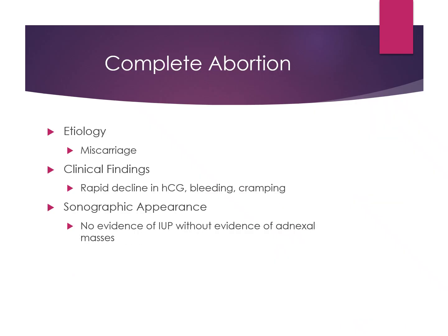So a complete abortion, on the other hand, is not going to be considered a demise. It is considered a complete abortion because everything was able to make its way out. So we had a pregnancy, mom came in because she's having severe bleeding, passing large blood clots. We go in to do an ultrasound. She's already had one at 6 weeks that said there was an IUP. She comes back at 9 weeks and there's nothing. This is a complete abortion.